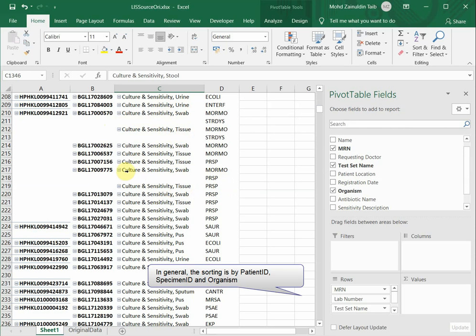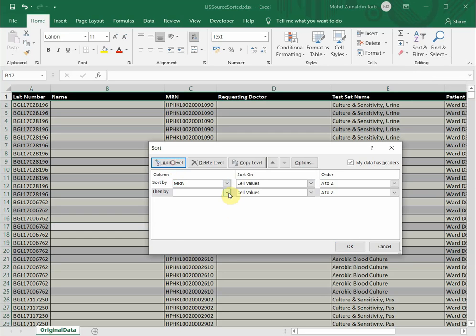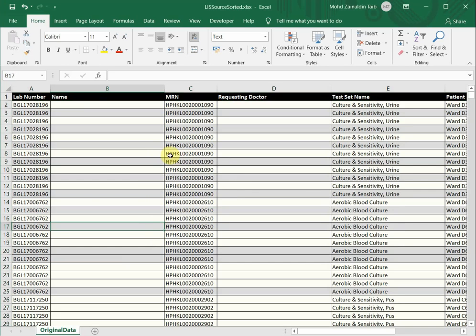So it's quite different. That's why it's very specific for this particular lab's record, to put the specimen here. How to sort this out? In the original data, go to custom sort. First sorting is by MRN, which represents the patient. Then by lab number. Then for this particular case, we should have the specimen. Then the last one is organisms. Generally, with the assumption that one lab number is just for one specimen, we don't need to have specimen here. Now it is already sorted.